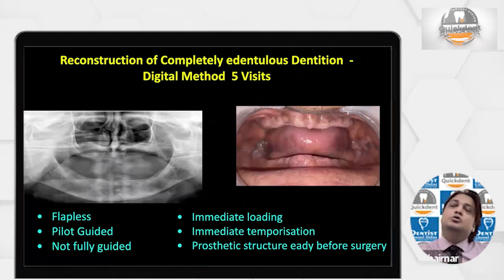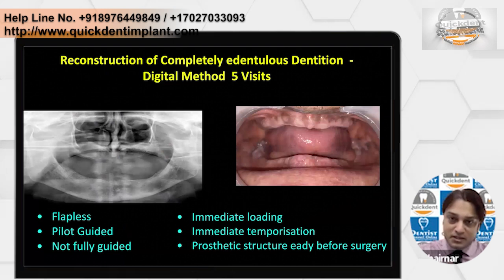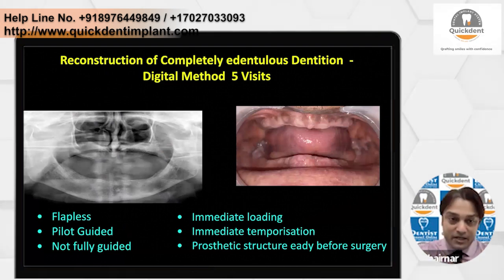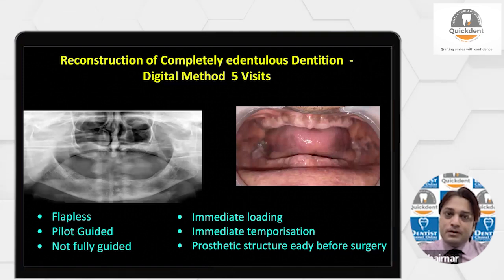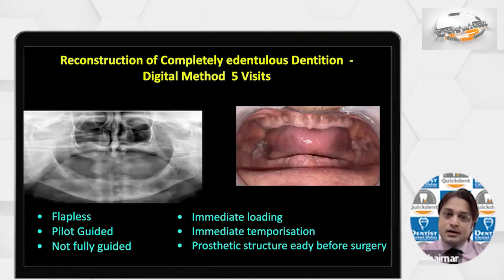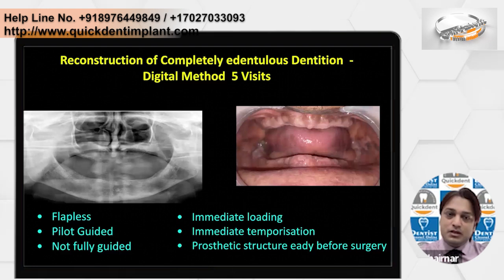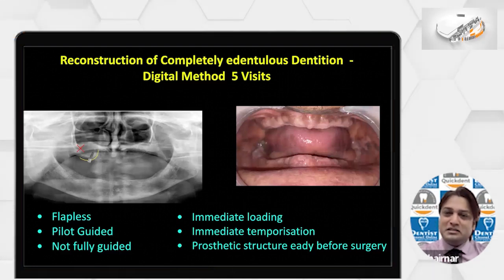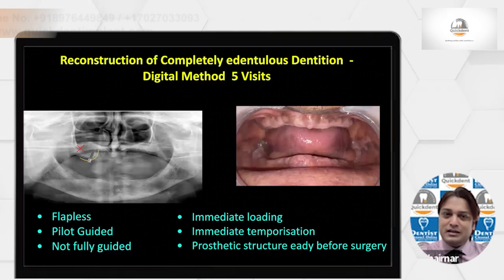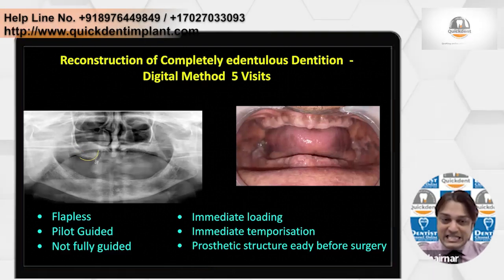So that's how we used to do it for a totally compromised dentition where the majority of the teeth are present and in decent alignment. Now, the case where the teeth are totally absent: the problem with such cases is that if you do flapless surgery, you are not in a position to understand, for example with the sinus anterior wall, whether your implant will be in the sinus or you have to do the osteotomy anterior to the sinus. Sometimes it is not easy.